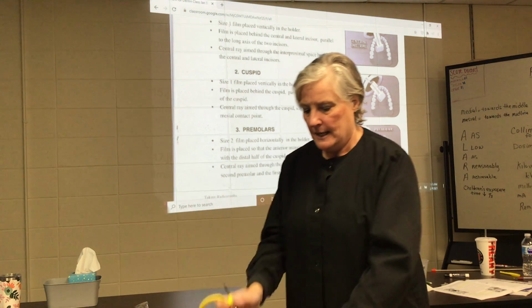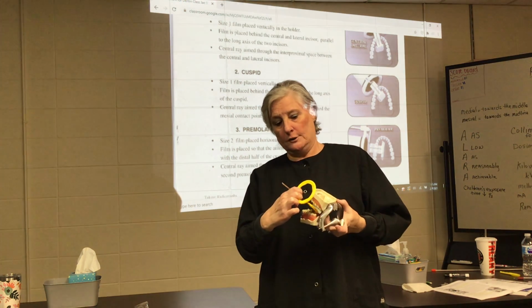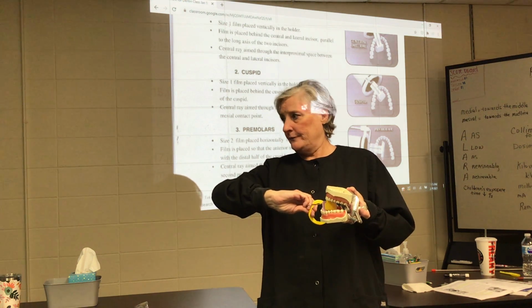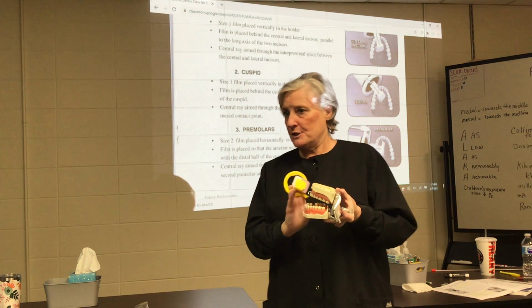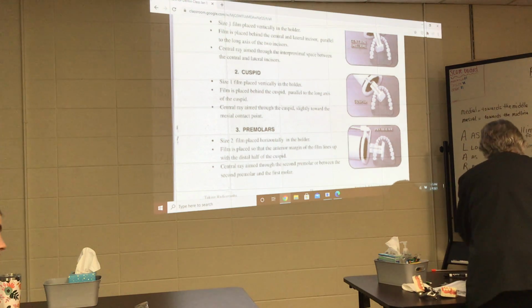ring, I'm good. So now I'm set up to take the upper left molar, premolar, the lower left molar, premolar. Okay? Now we've taken 6 of the anteriors, we've taken 8 posterior, let's take some bite wings. Because that's all, and then we'll be done on FMX.